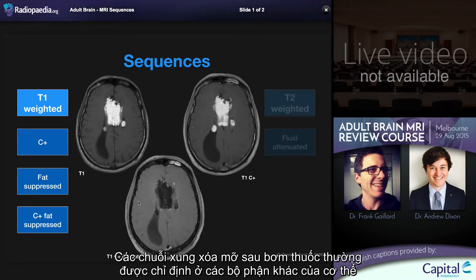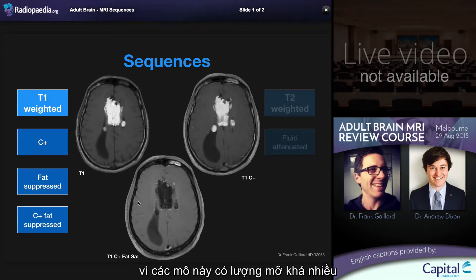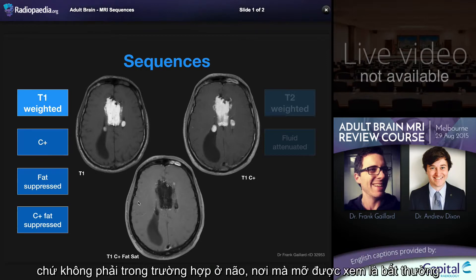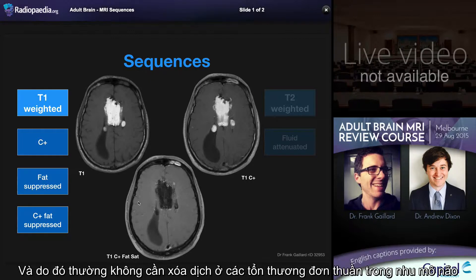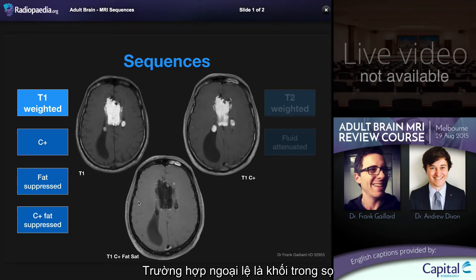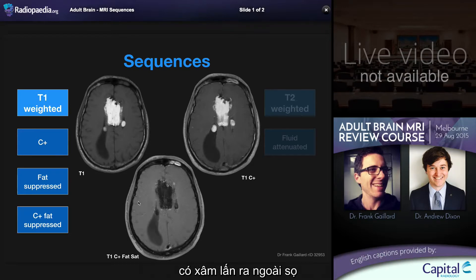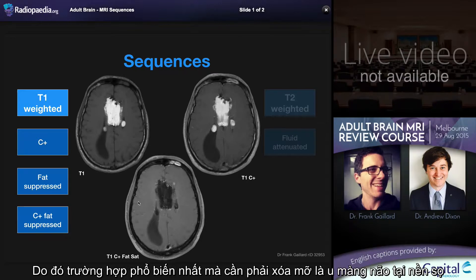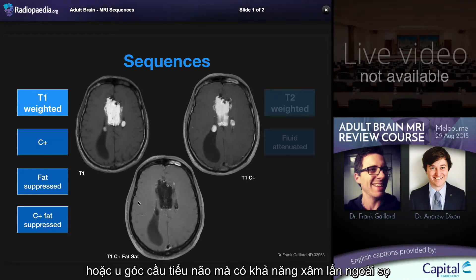Fat saturated post-contrast T1 sequences are routine in most parts of the body because of the presence of significant amounts of fat. This is not the case in the brain, where fat is an abnormal substance, and as such for purely intraparenchymal lesions fat saturation is usually not performed. The exception is intracranial masses involving the skull or skull base where extracranial extension is being sought — the most common situations being base of skull meningiomas or cerebellopontine angle masses where potential for extracranial spread is present.